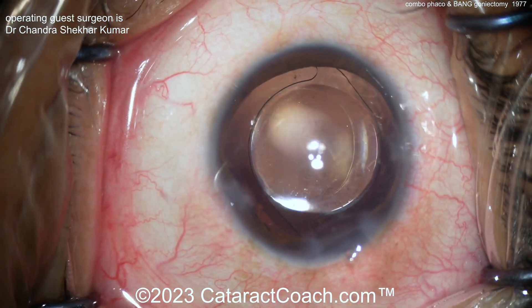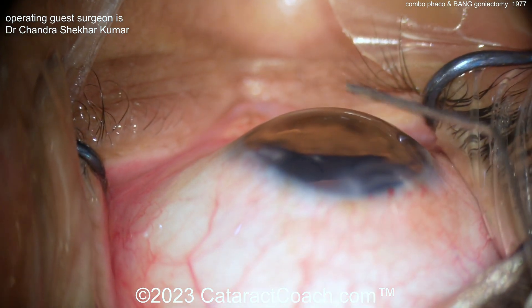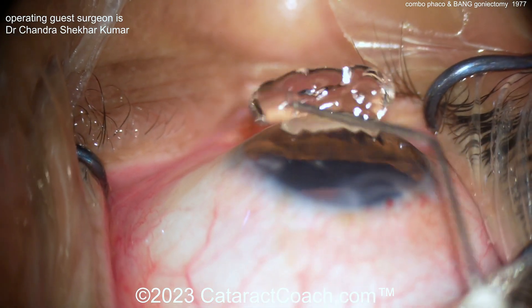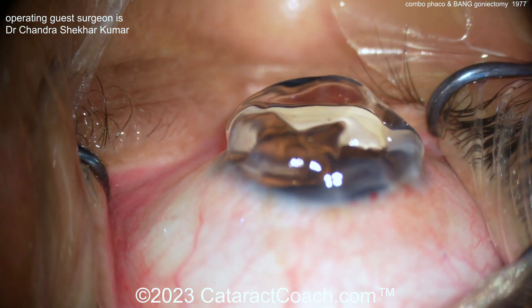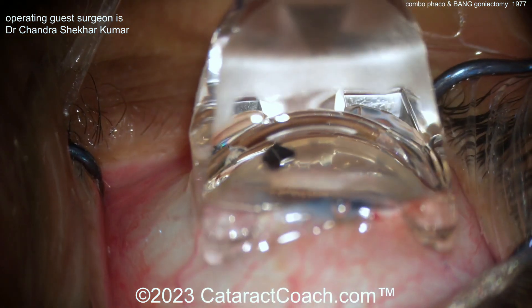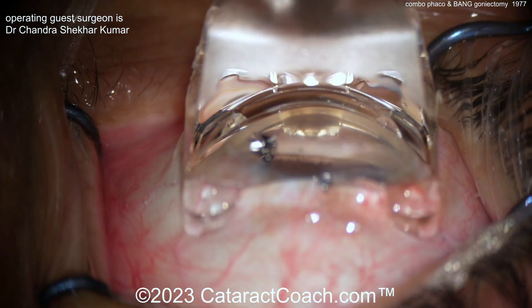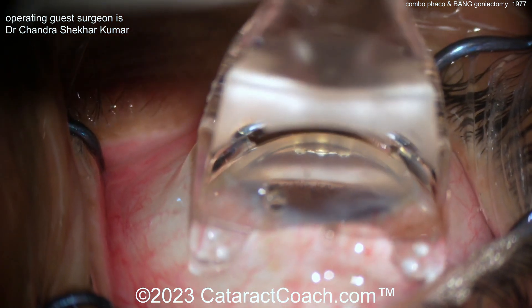Now extra viscoelastic fill, then switching over. You have to be operating temporally to get access to that angle. Here's the viscoelastic on the cornea — notice how there is no bleeding anywhere. Now you can place the gonial prism. Remember, the patient's head is turned away from you and you've tilted the microscope towards you. There goes the prism, and you can get the view — look at that beautiful view of the angle.